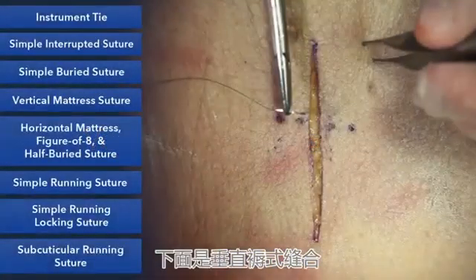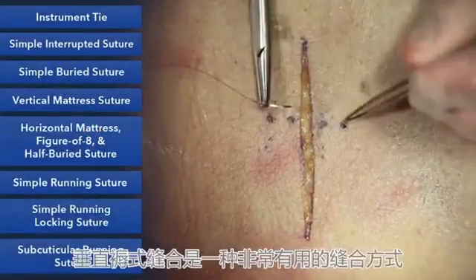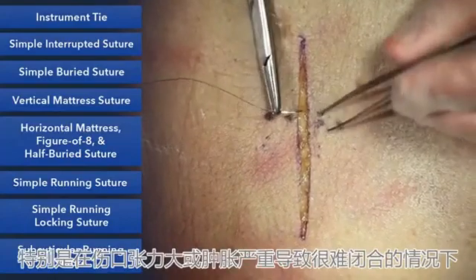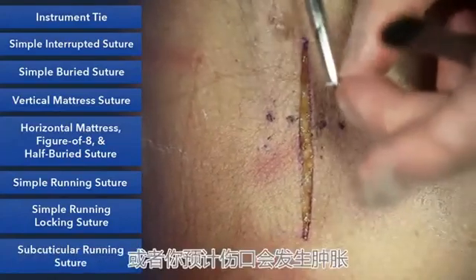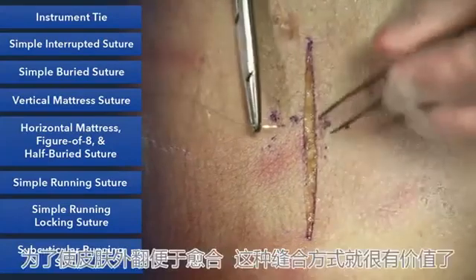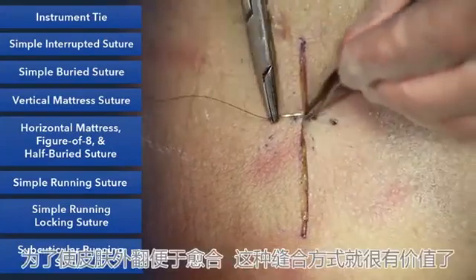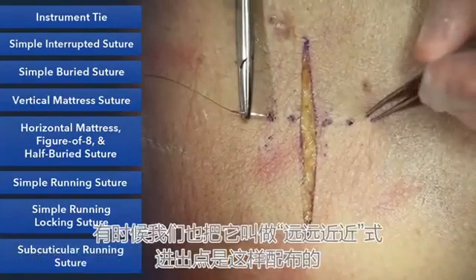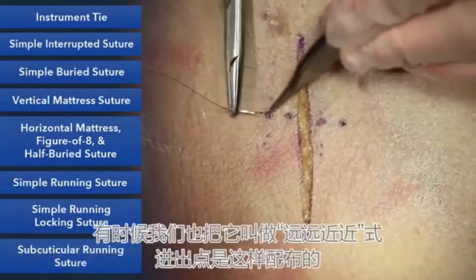Next is the vertical mattress suture. Vertical mattress suture is a very useful suture, especially when wounds are hard to close, if they're under a lot of tension, or maybe there's a lot of swelling, or you anticipate swelling. It's especially valuable when skin edges want to keep rolling in and you want to evert them. Some will call this the far, far, near, near stitch, and this is the configuration of your suturing.